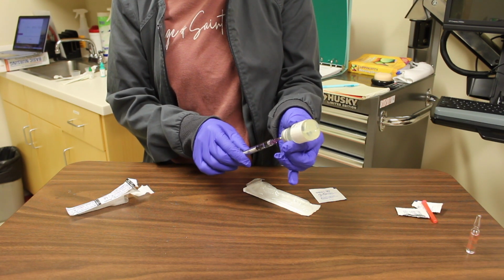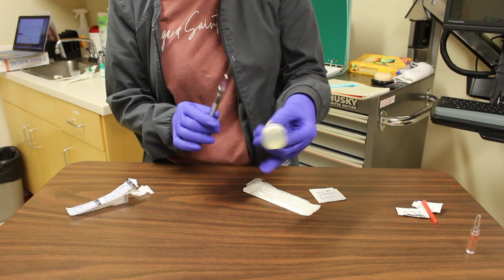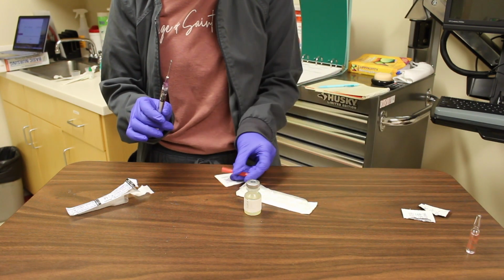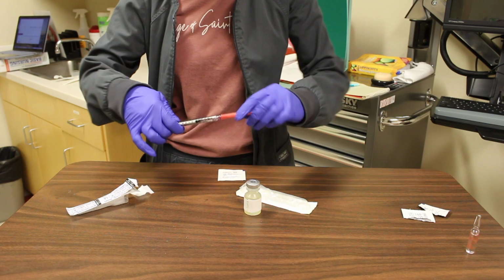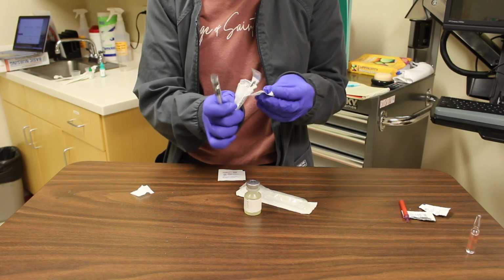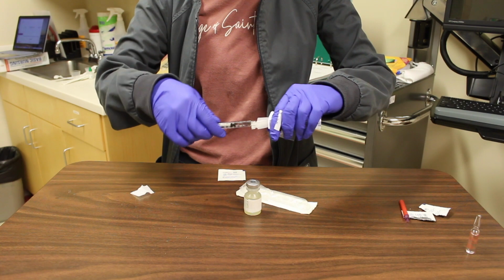When the dose is correct, withdraw the needle at a 90-degree angle. Hold the syringe upright at eye level to recheck the medication dose. Recap the blunt needle using the one-handed method. Remove the attached blunt needle and replace with the proper needle needed for medication administration, being sure not to break sterile technique. Properly dispose of the vial and blunt needle in the sharps container.